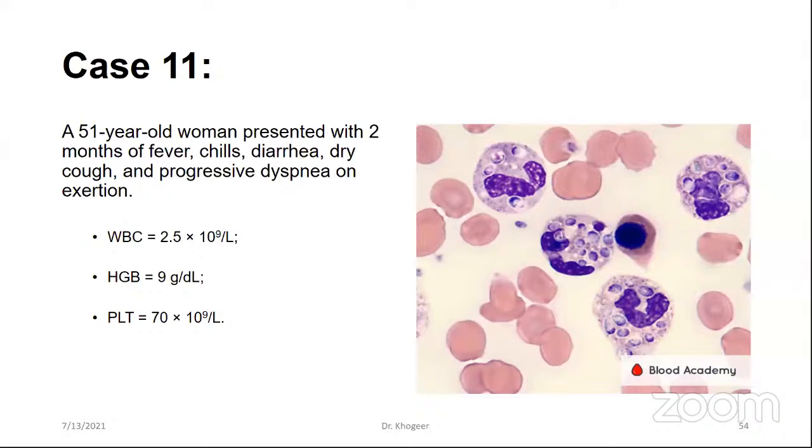So in a normal person, obviously you should not see neutrophils with toxic granulation, but sometimes the staining process may make these neutrophils show their granules darker, and it can be a false finding.